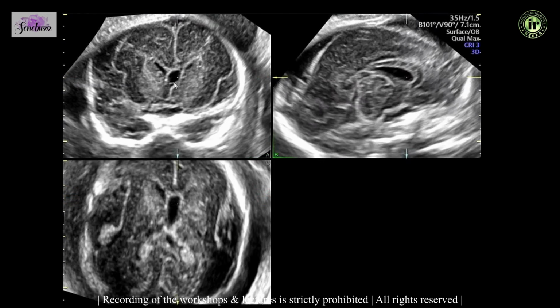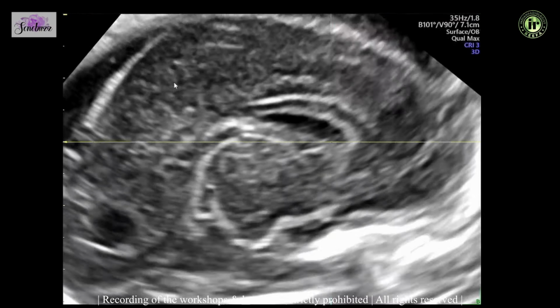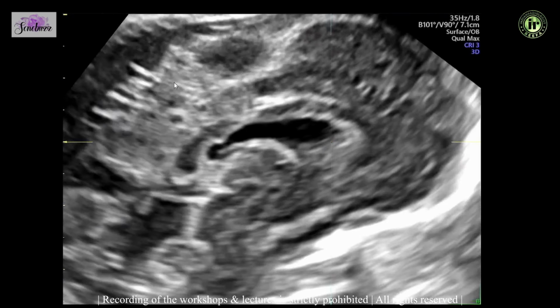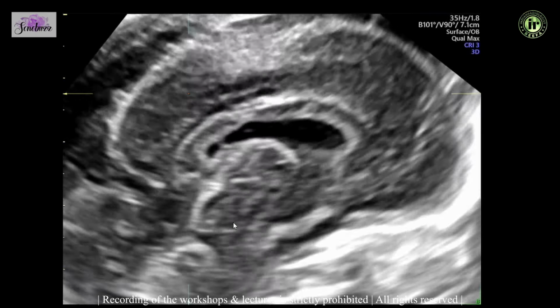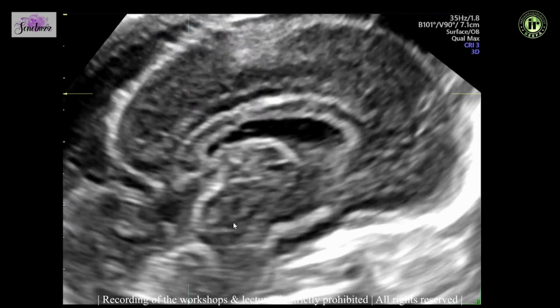So this is a perfect midline. We can magnify. You can even take it as a single image. And you can see the entire corpus callosum very well. So that's the corpus callosum here. You can see the entire body of the corpus callosum, the cavum septum, and you can scroll in and out of the image.